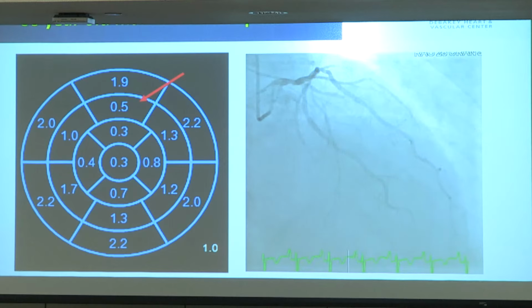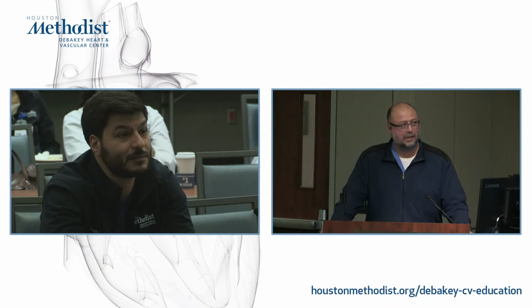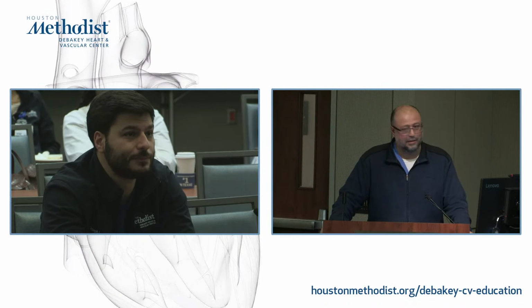All right, so let's compare this to this case and then we can potentially stop. What do you think of this case? No tricks here. Looks normal. Both stress and rest look normal, right? Yes. But looking at the calcium, this is even worse calcium, 3,313.